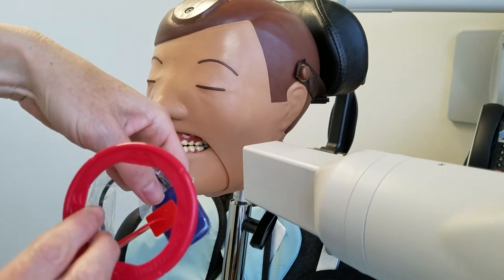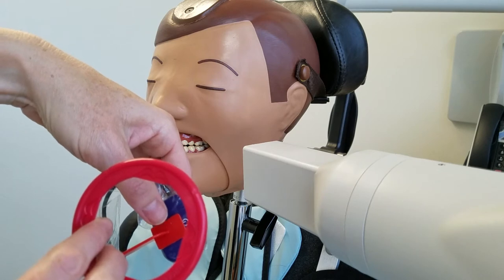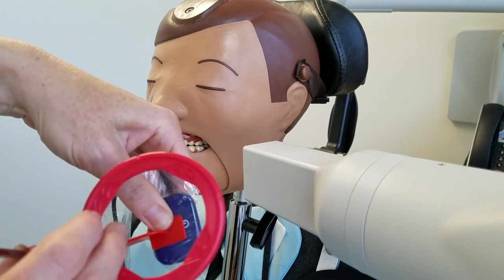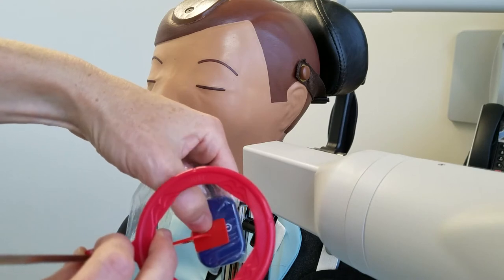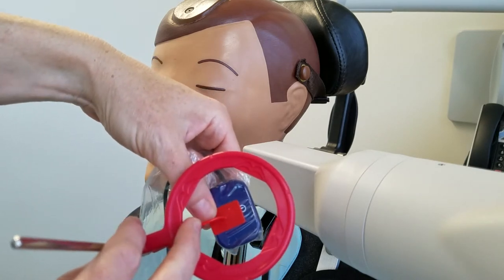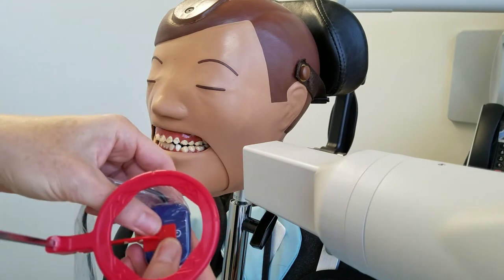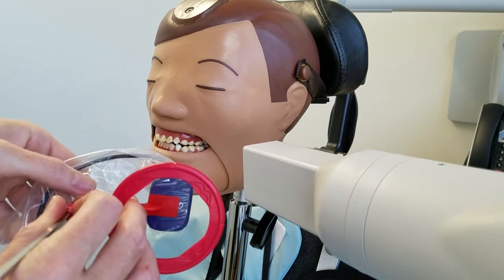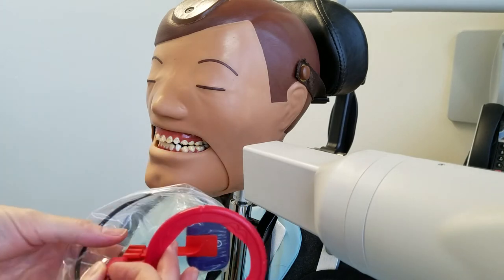You're still going to keep the sticky part off to the side so that your sensor is still in the center of your target, because if you move it further over, you're not going to be centered in the target. So you want to offset it a little bit. Rotate your sensor on the bite block for the verticals, and make sure your cord stays out of the way and that Dexter doesn't bite on your cord.